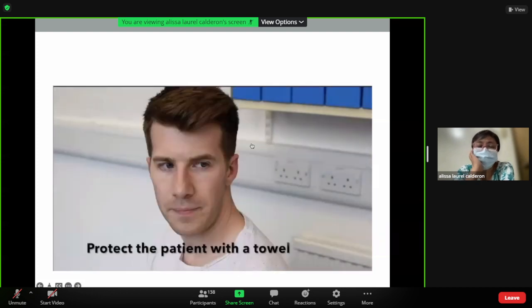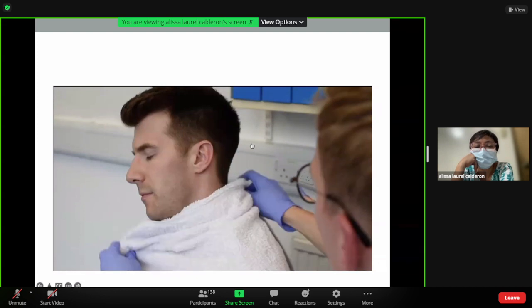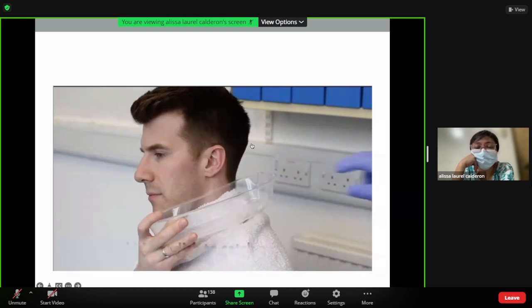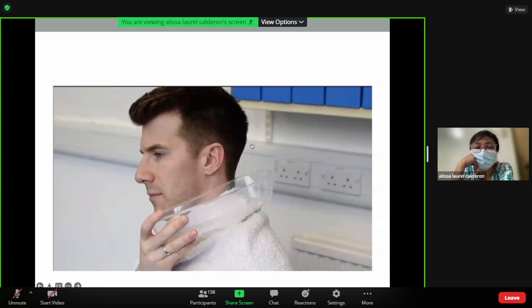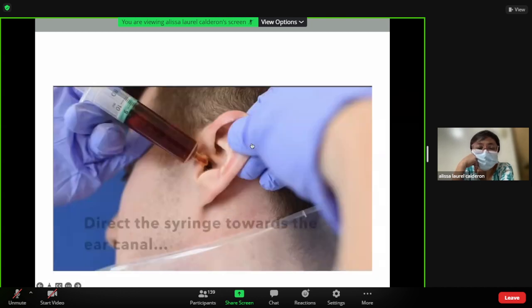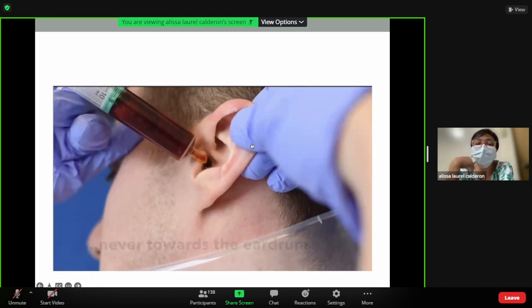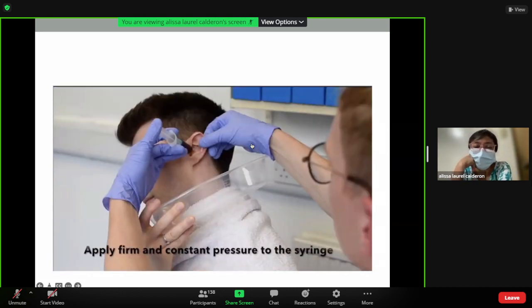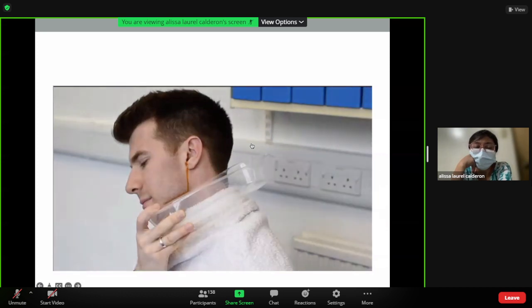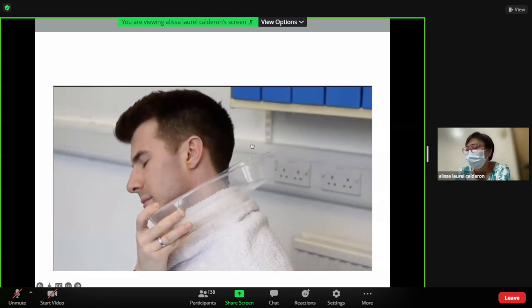Okay, I'm going to place this over your shoulder. And can I ask you to hold this under your ear? Okay, towards ear canal, not in the ear gap. I'm just going to clean your ear, okay?